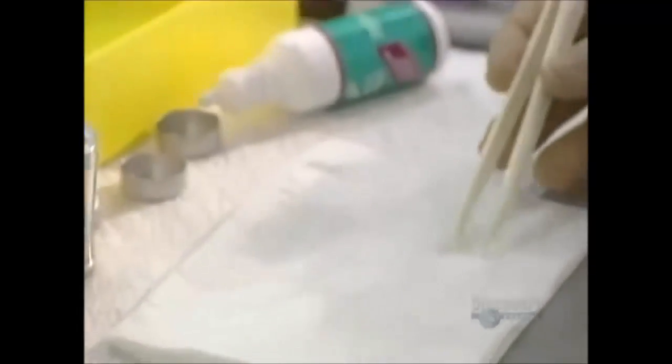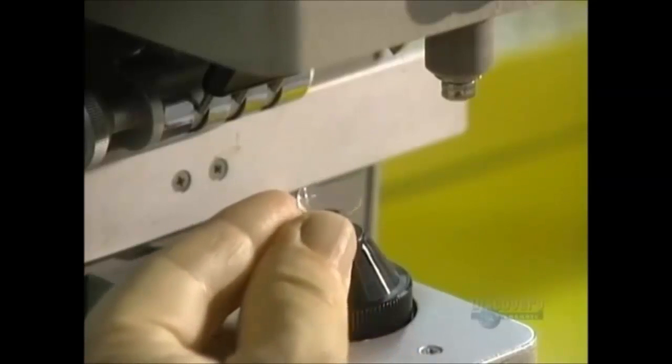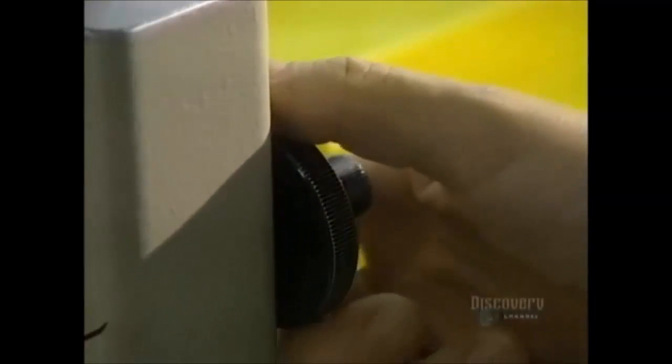We now proceed with another important testing procedure. The soft, fragile lenses are always handled with the greatest of care. This unit, called a frontofocal meter, is a metering device which verifies the optical precision of the lens.